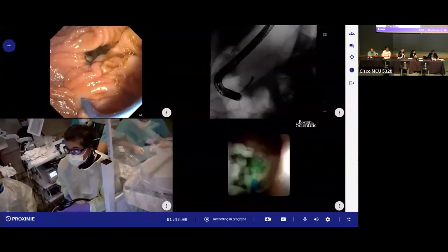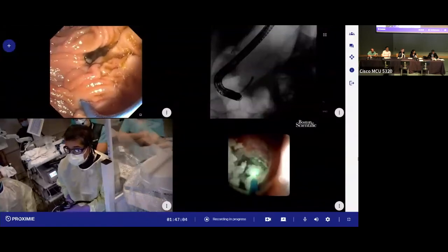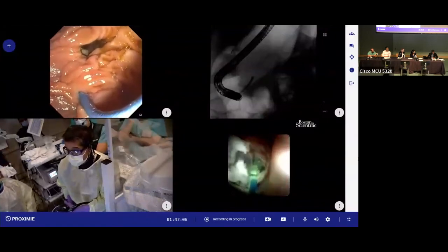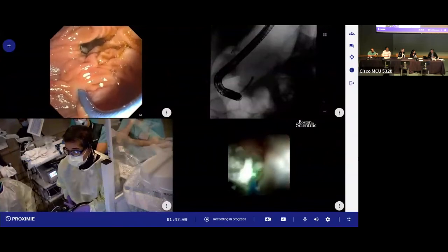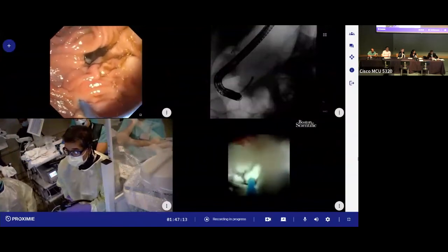So that's kind of what we're doing here. I think the laser stricturoplasty part is pretty much done. We are just going to get a wire. How much time do you have with me, Sachin? I have a few minutes with you, Raj.